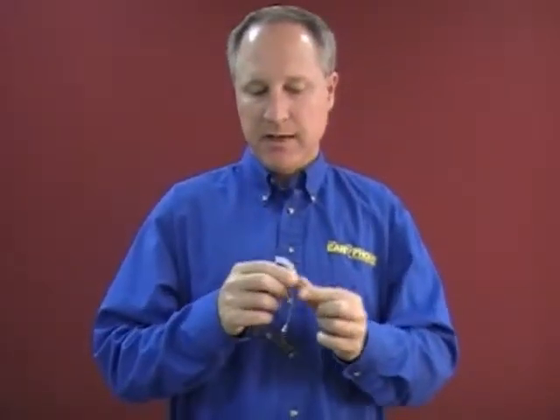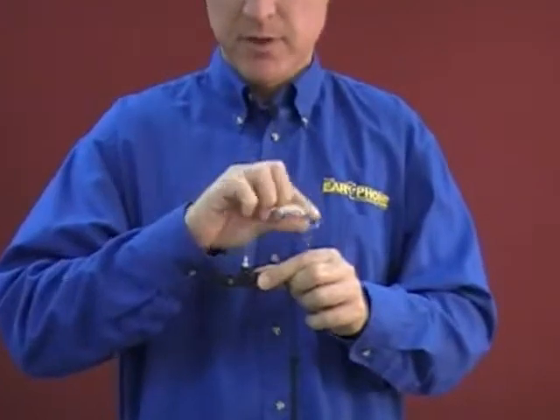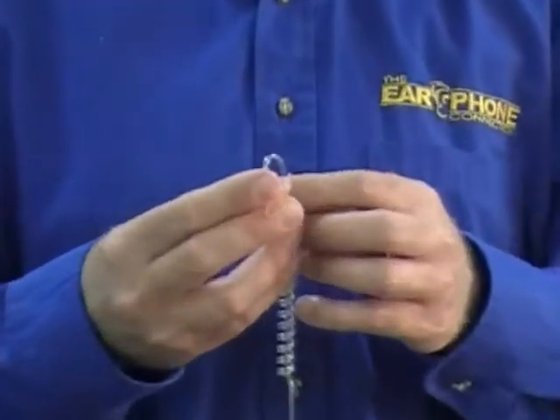Now I'm going to install it to the tube. On the clear tube, you'll see the elbow. Attached to the rest of the tube will be the connection to the speaker — they also call this a transducer. You take the flat side of the ear mold and attach it to the elbow.